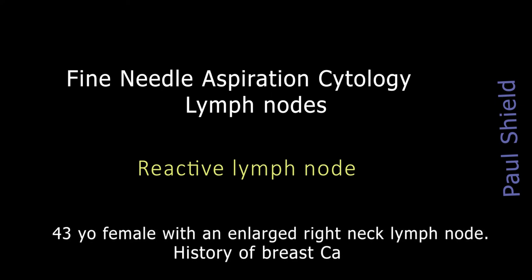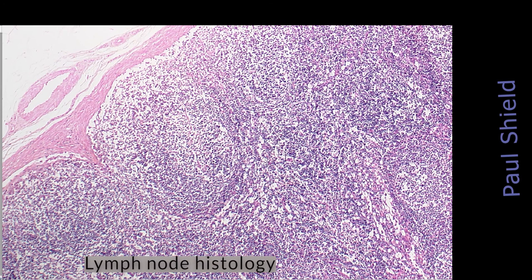Hi, it's Paul. In this clip I want to look at reactive lymph nodes, in this case in the context of a 43-year-old female who had an enlarged right neck node and a history of breast cancer. I just want to initially review normal lymph node histology with you.